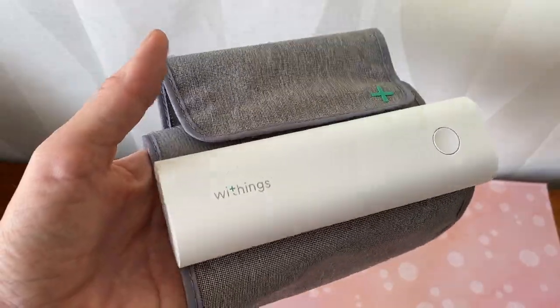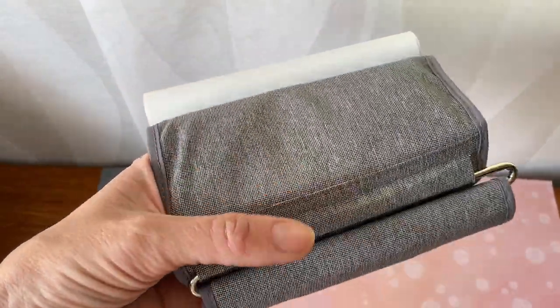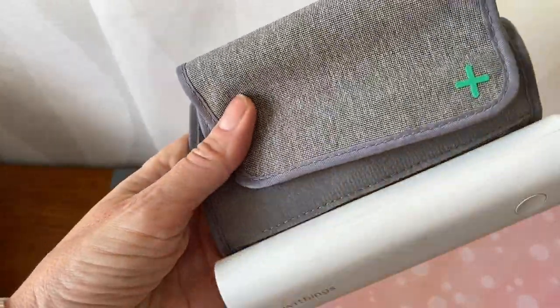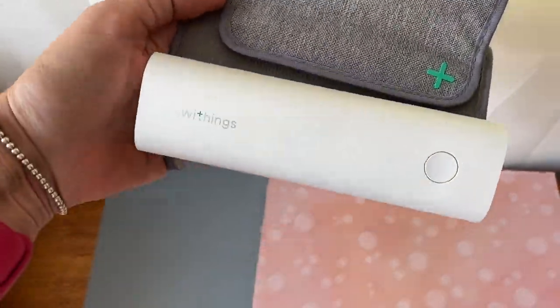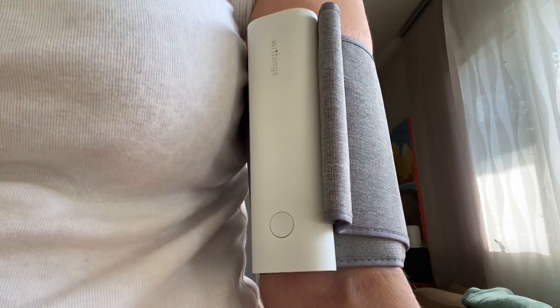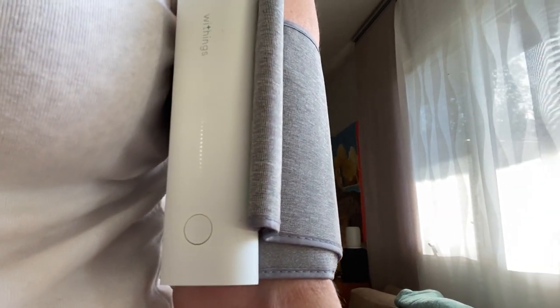Now let's talk about accuracy with this device. Withings says the BPM Connect has been thoroughly tested to ensure it gives you highly accurate results. While I don't have access to medical equipment to verify it, the readings seemed accurate for what I know about my own baselines. I also had several friends and family members test it and most said the BPM Connect did line up with their usual levels as well. I also compared the heart rate taken by the BPM Connect to my Apple Watch and found that they are pretty much the same.